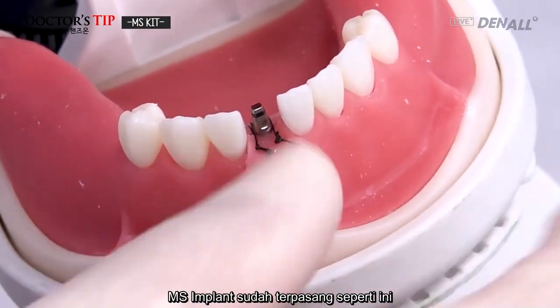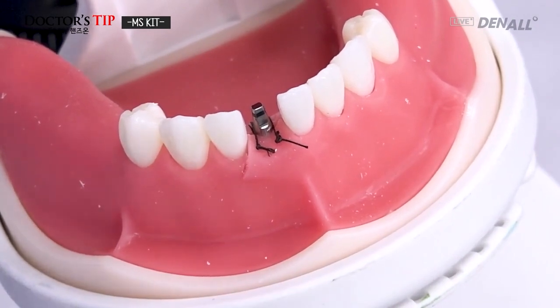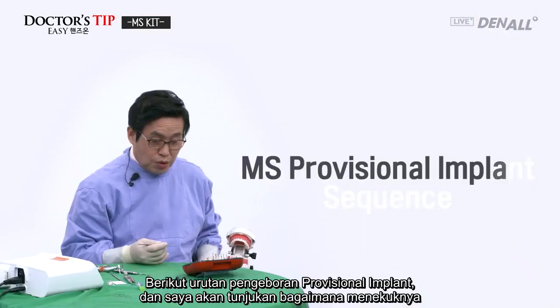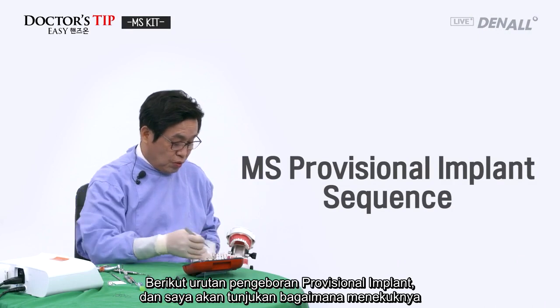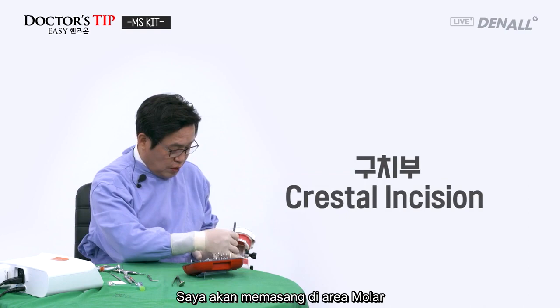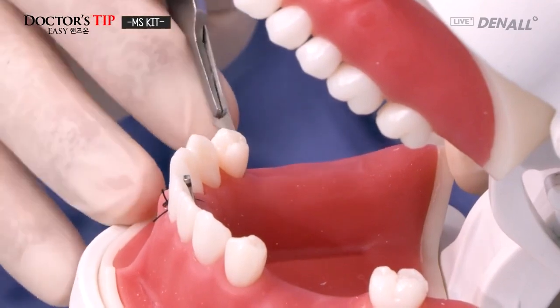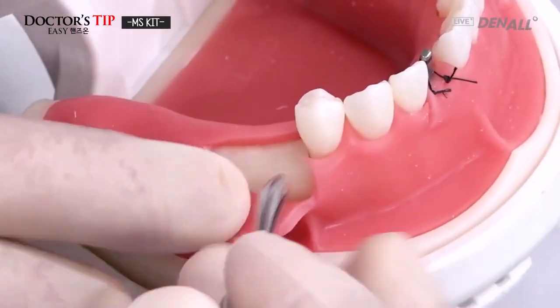Like this, and the MS implant is placed, and now you can create a provisional restoration. Next, let's see the provisional implant sequence, and I'll show you how it can be bent. So I'll put one on the molar area, crestal incision, and then the flap is elevated.